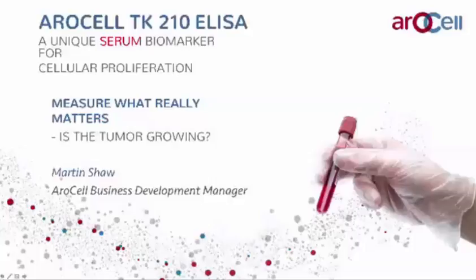We have a question from Lordanas. In the breast cancer data, which TK activity assay did you compare with? Liaison? We do have some studies with Liaison, but in that study, this is Martin Shaw speaking, we compared with the gold standard tritium-labeled thymidine assay. So in our studies, we always refer to the gold standard tritiated assay, but we do have other data showing a good correlation with the Liaison assay.